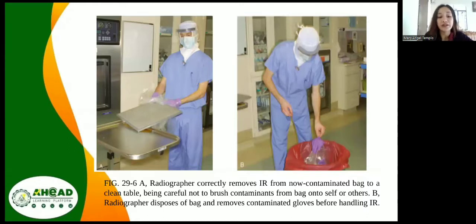Figure 29-6. A radiographer correctly removes the IR from the now contaminated bag to a clean table, being careful not to brush contaminants from the bag onto self or others. In picture B, the radiographer disposes of the bag and removes contaminated gloves before handling the IR.